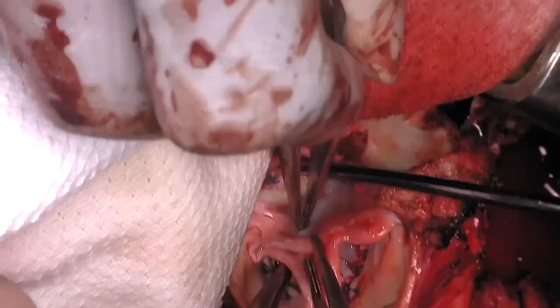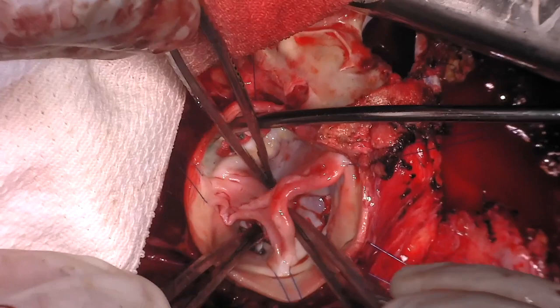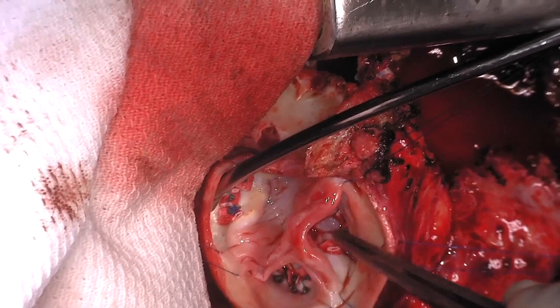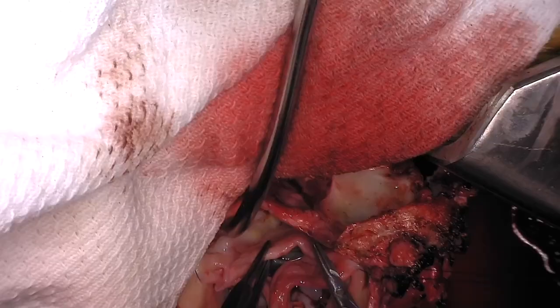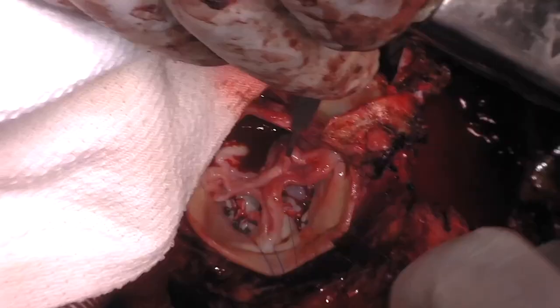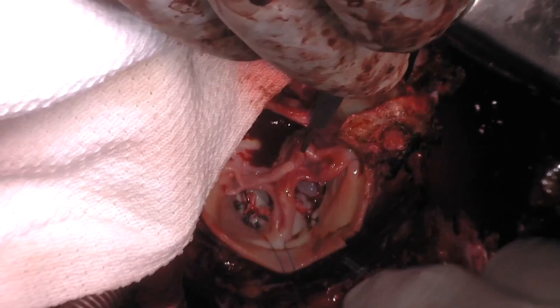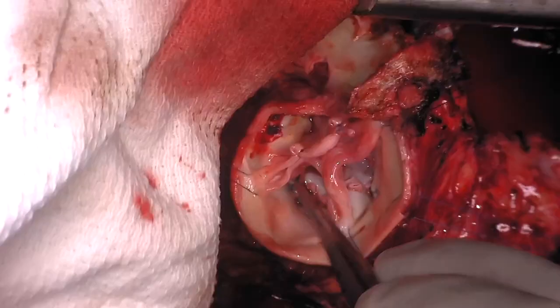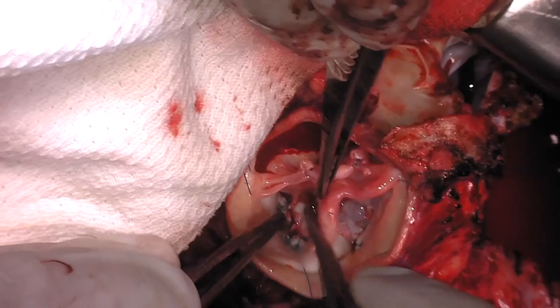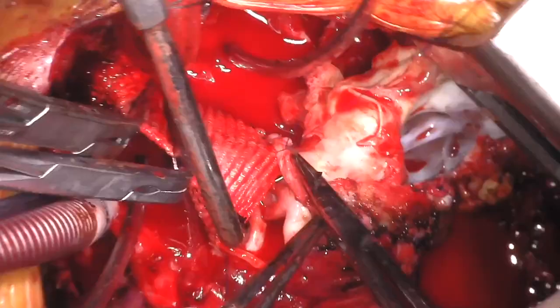Leaflet pressurization shows an abnormally high right coronary leaflet related to the underlying VSD patch that has elevated the leaflet. The left coronary leaflet is prolapsing and will be plicated to raise its effective height. The left coronary leaflet is plicated multiple times, and now there is good apposition.